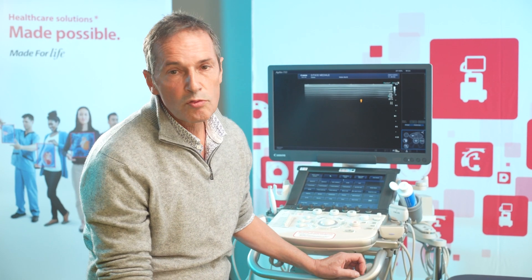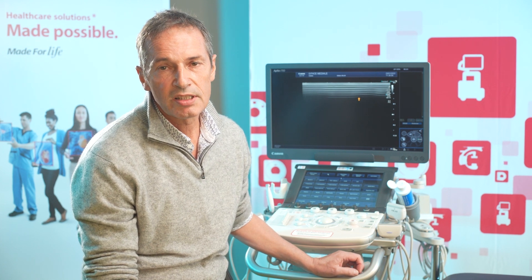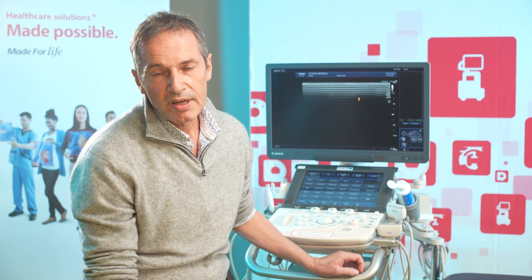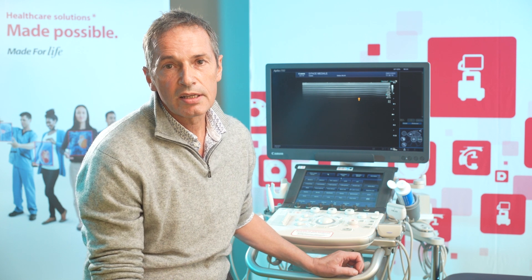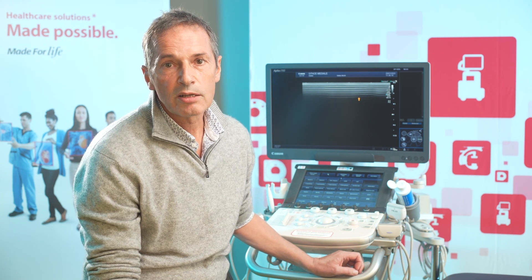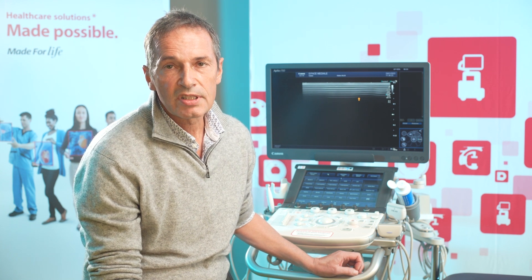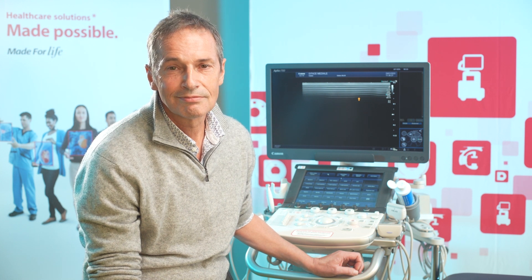So, I just showed you what I'll call a checklist to follow when exploring the medial aspect of the elbow. The main indications are articular, tendinous, and ligamentous. As you can see, we can assess these structures in a systematic way, reviewing the various tendons and lesions of the ulnar collateral ligament, using a properly conducted ultrasound exam with the patient in the right position. Now it's your turn.